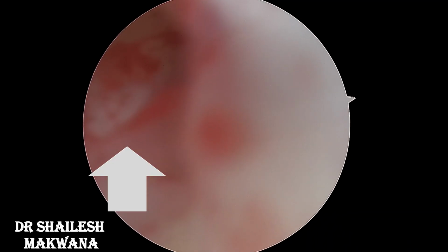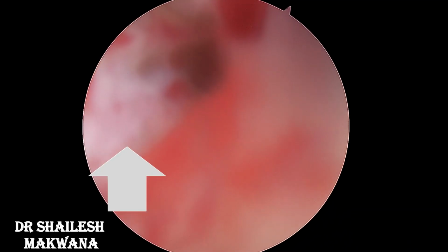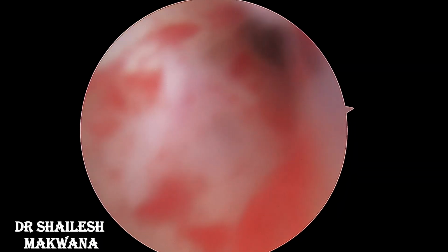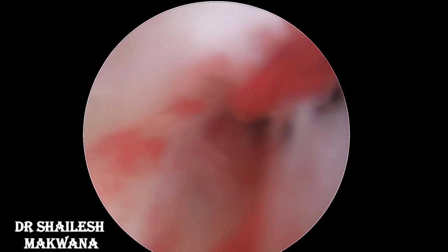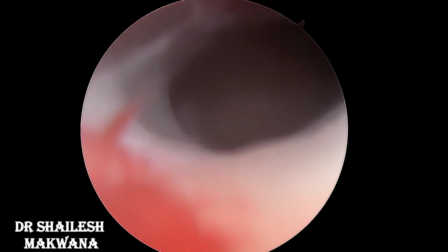So we proceeded safely with the hysteroscopy, and we were able to see the cervical canal, and we tried to negotiate our hysteroscope through that opening, and we just increased the level of the pressure, and the adhesions got lysed by the pressure. If the adhesions are dense, we may need to use a hysteroscopic scissor. After the adhesions were released, we were able to enter the uterine cavity.